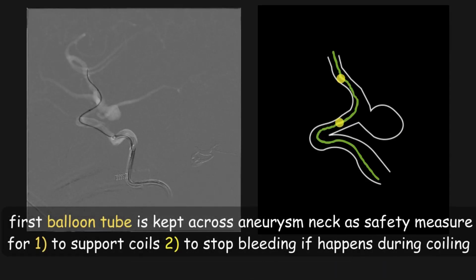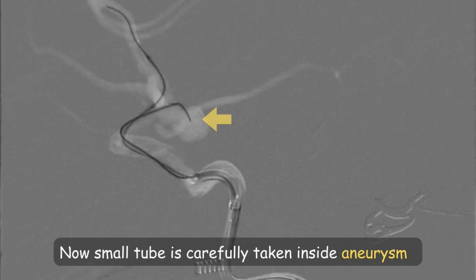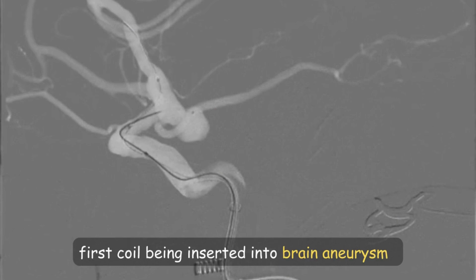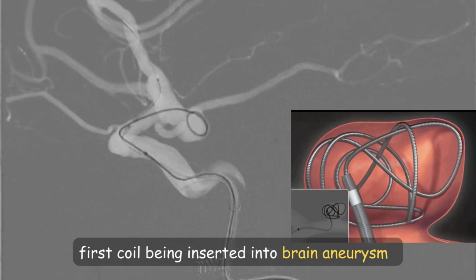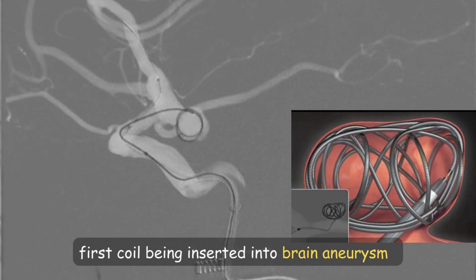The first balloon is kept across the neck of the aneurysm to prevent bleeding if it happens during the coiling. Now the small tube is carefully taken inside the aneurysm over the micro wire. Through this small tube, we are going to insert the coils inside the aneurysm. Very gently we need to take this tube. Now the first coil is inserted inside the aneurysm. The size of the coil is decided after measuring the size of the aneurysm.